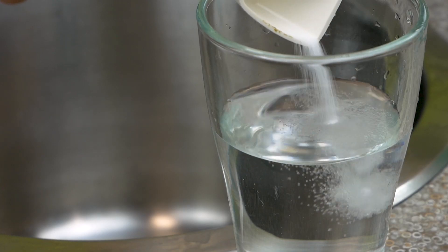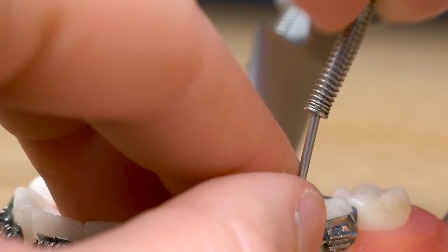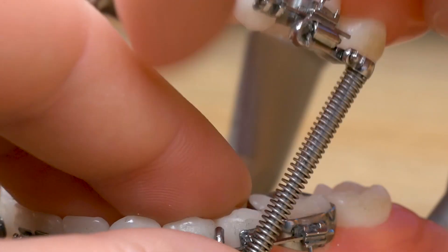If you develop irritation in your cheek, rinse your mouth with warm salt water. If a rod comes out of the spring, have a parent place the rod back into the spring.